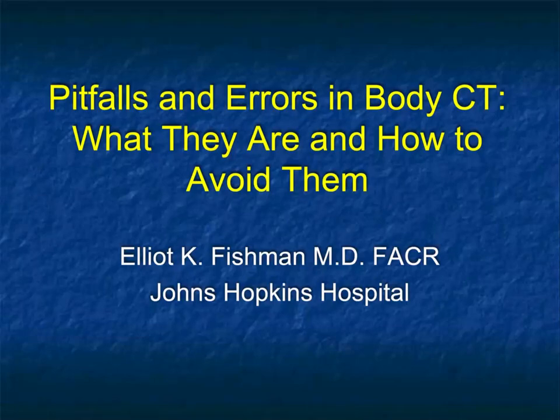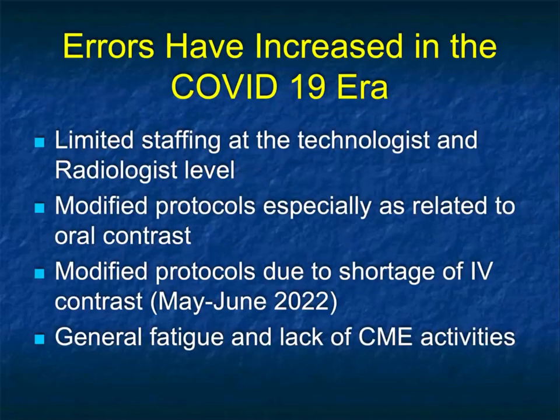And this is going to be on pitfalls and errors in body CT, what they are and how to avoid them. I think all of us know that we're getting busier and busier in practice. The cases are becoming more and more difficult, and we're trying our best to get every case read correctly. But the reality is there are all sorts of issues. And I thought about it.